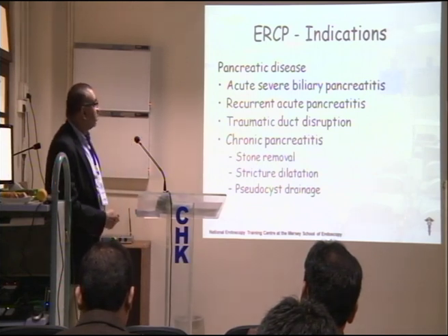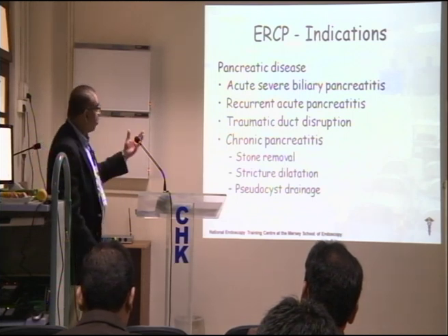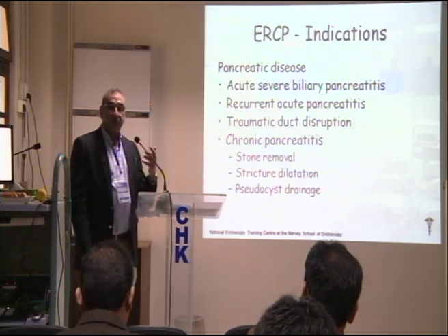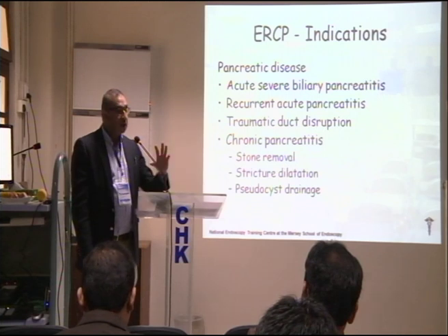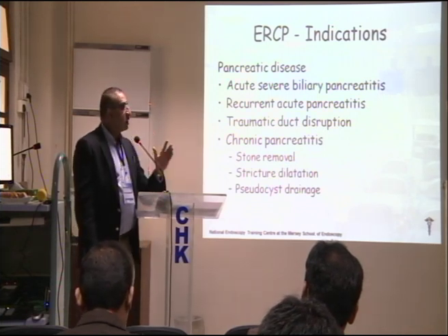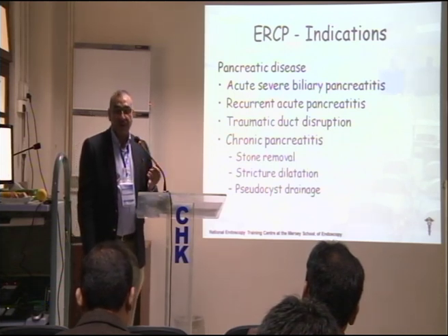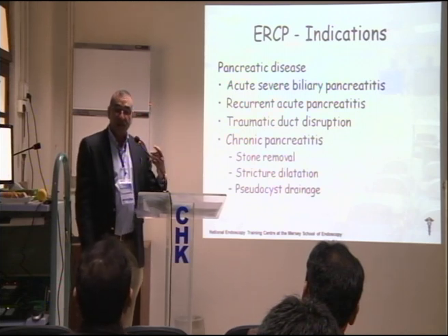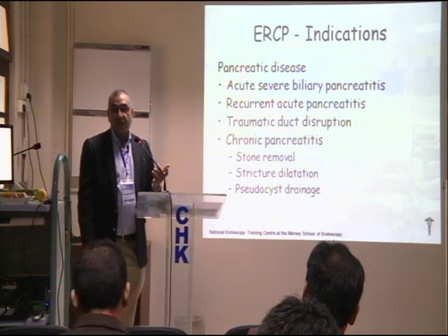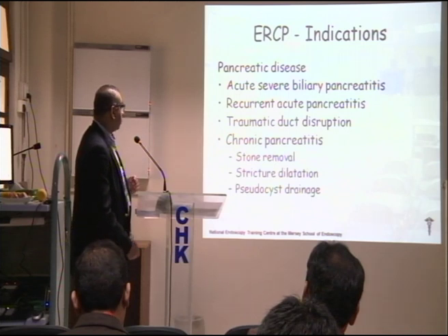In that case, it should be done only by people who are experts, because the whole anatomy in that area is altered. The whole papilla is swollen, the duodenum is swollen, the papilla is twisted in a skewed position, you can't get to it easily. So it's a high-risk procedure. It has to be done by people who are experienced. Even in our hospital, I've got some very skilled ERCP endoscopists, but I'm the only person they usually refer the cases to. So it has to be done by a person who knows what they're doing.